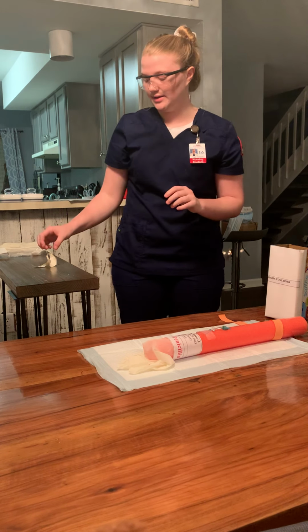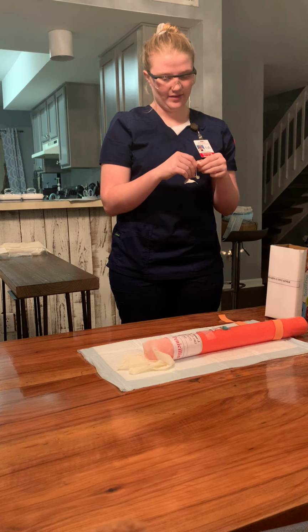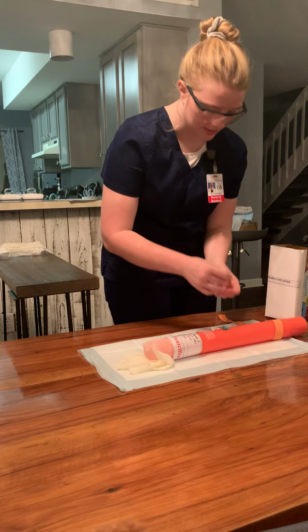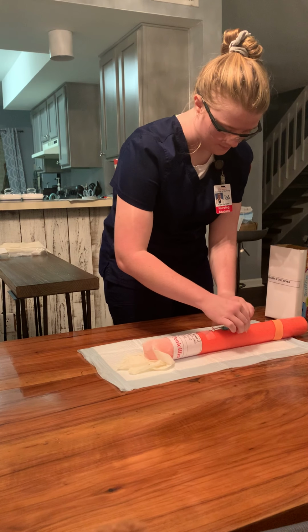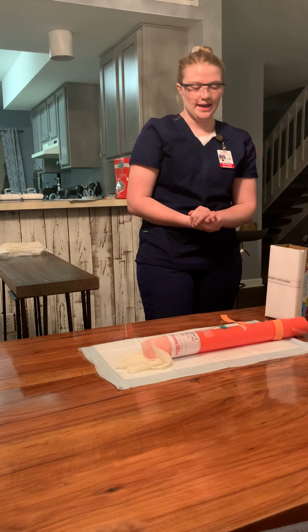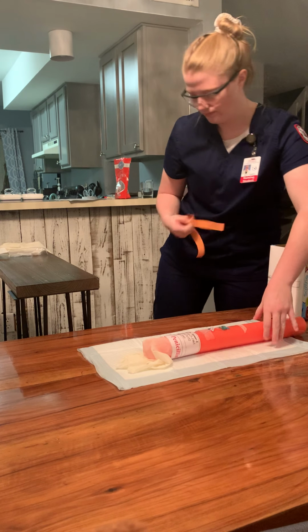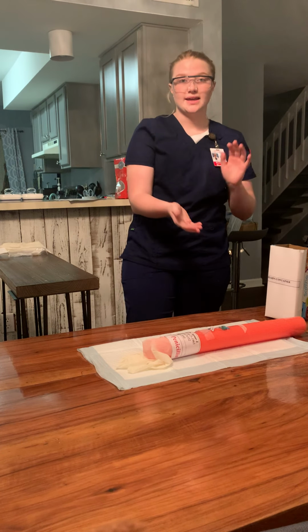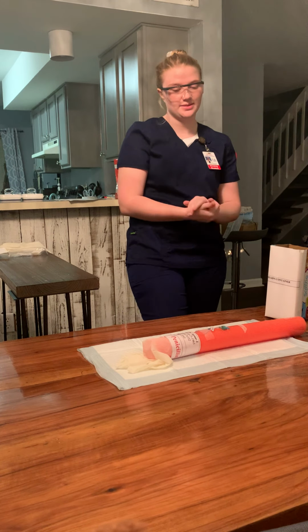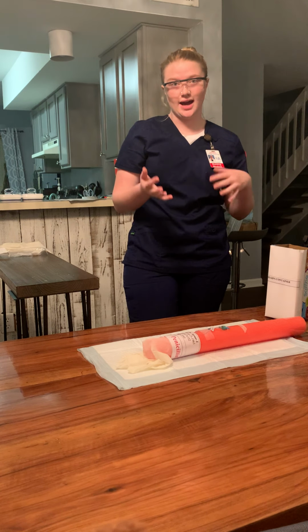and I would take a label and put the date, time, and gauge of the catheter on it, and apply it to my transparent dressing. And then I would put the date, time, and gauge of the catheter on the label or the piece of tape on the transparent dressing. And then I would inform the patient on how to not dislodge the IV.